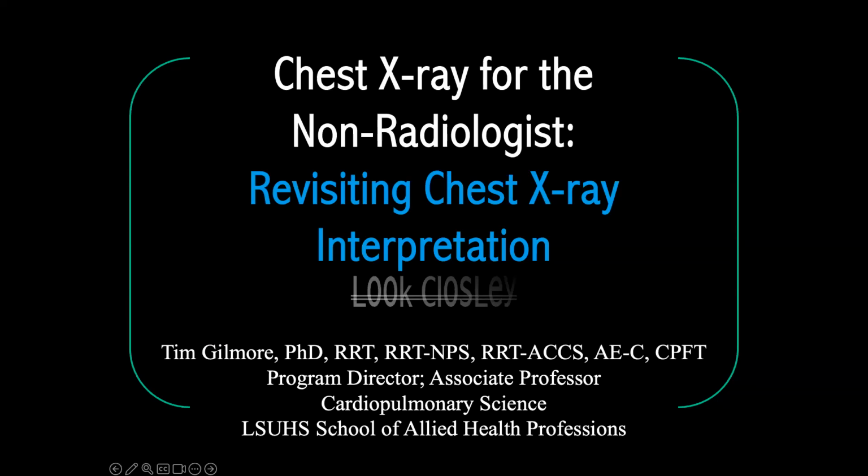I feel like the title is pretty self-explanatory, but just to get us warmed up a bit, surely you noticed where it says look closely at the bottom that the lettering displays variable shades of light and dark. It has a line slightly off-centered, and certain letters are capitalized, others not, and not in the normal expected sequence. Oh, and the word closely is purposefully misspelled.